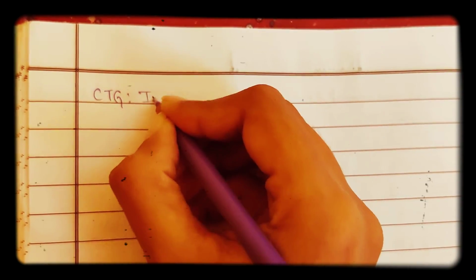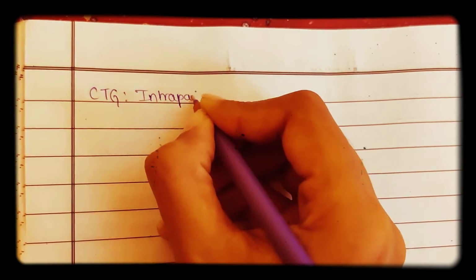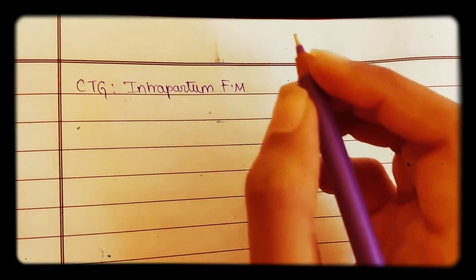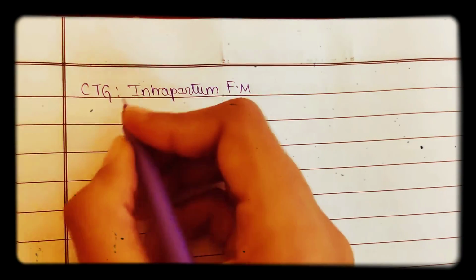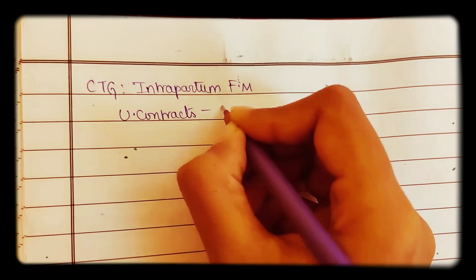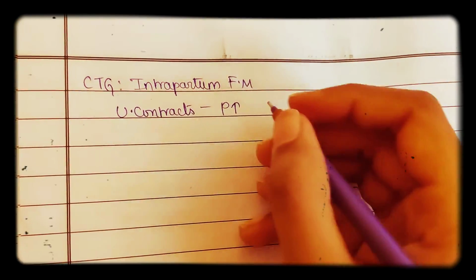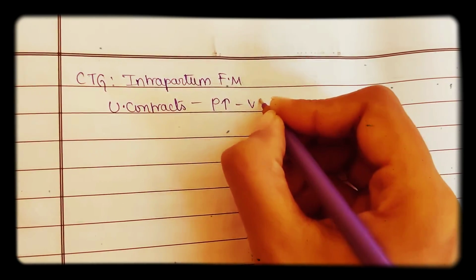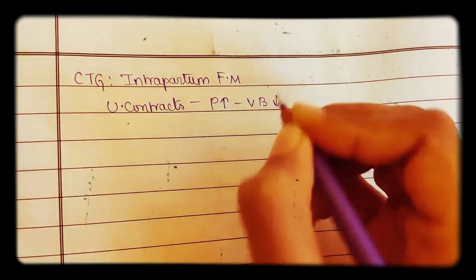So now let us discuss some details about CTG, that is cardiotocography. It is an intrapartum fetal monitoring, intrapartum, not antepartum. Okay, intrapartum fetal monitoring. When the uterus contracts, pressure increases in the uterus. As the pressure increases, volume decreases, as they are inversely proportional. So the volume of blood going to the fetus decreases.